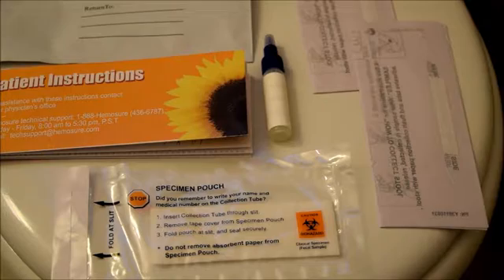You've been given this test by your physician or a lab. It's very important that you return this test to them as soon as possible. Since there is no preparation required, you should be able to complete this test and return it to them within a day or two. This is a very inexpensive yet very important test for you to complete, as it can detect precursors to colorectal cancer or any number of lower GI disorders that you may have.